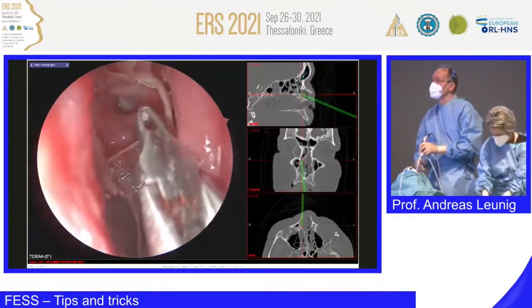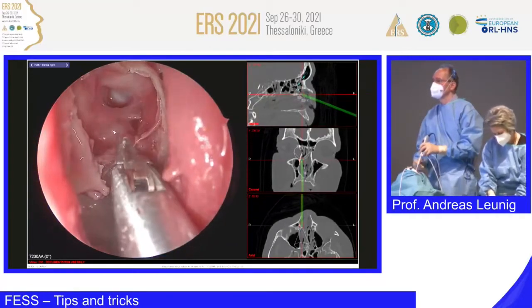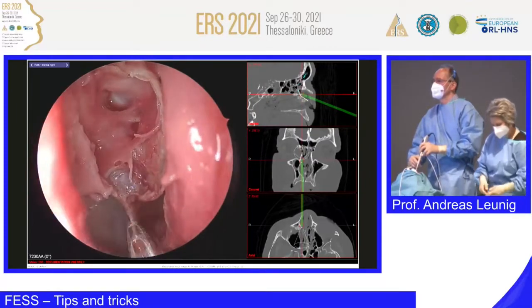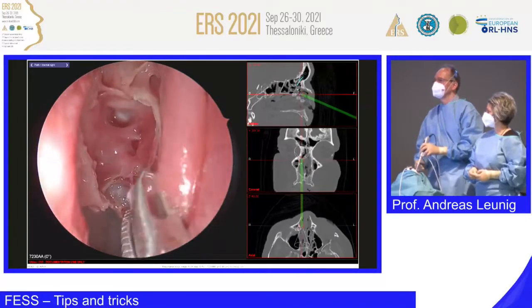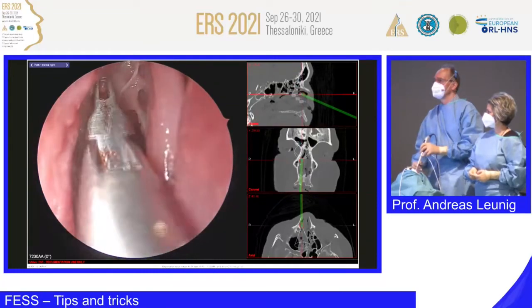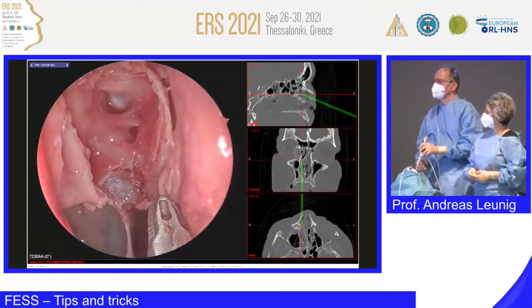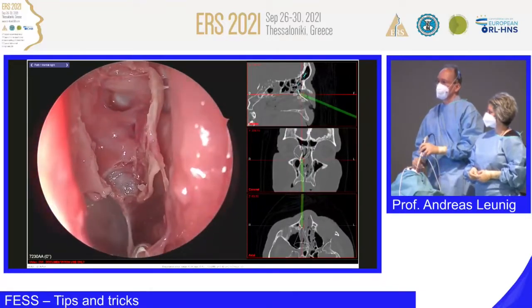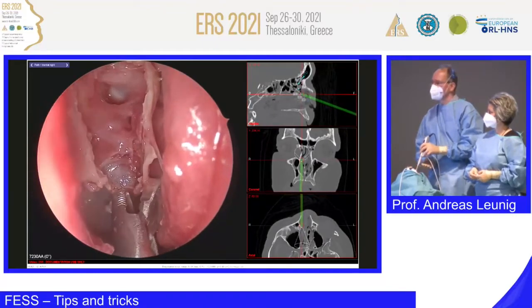So, what is important when we're dealing with the ethmoidal bulla? Which lamella? In a lot of cases, when you look in patients who were operated, you will see that the medial wall of the ethmoidal bulla is still in place. It's this one here, and that's the source of recurrent infection. So we have to resect this as well.